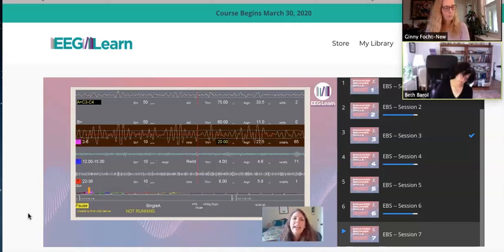Okay, so we'd like our 2 to 6 hertz activity to be somewhere between 6 to 9 microvolts. So like I was saying before, at a C3 minus C4 hookup, we're not looking at the average amplitudes at C3. We're not looking at the average amplitudes at C4. We're looking at the difference between the amplitudes at C3 versus C4.